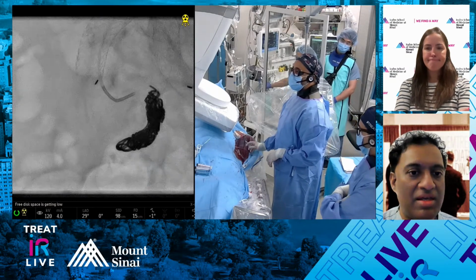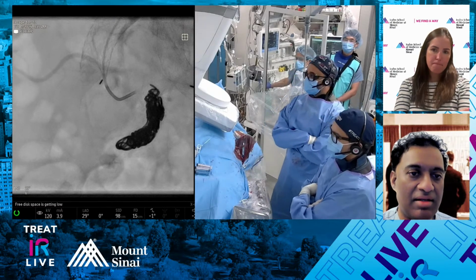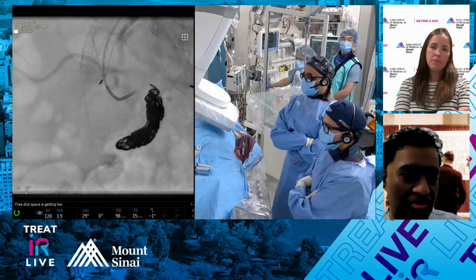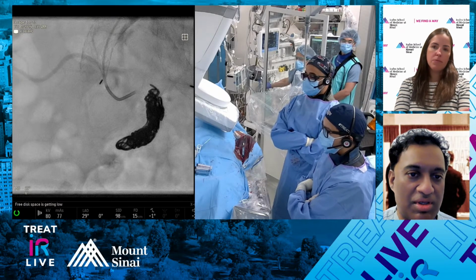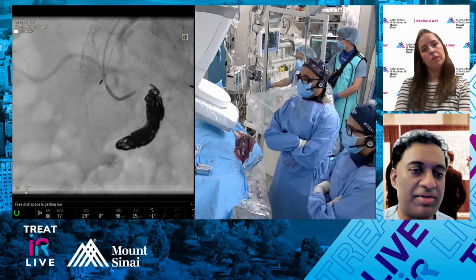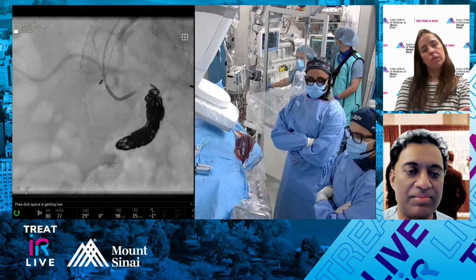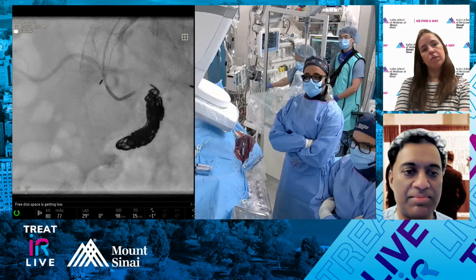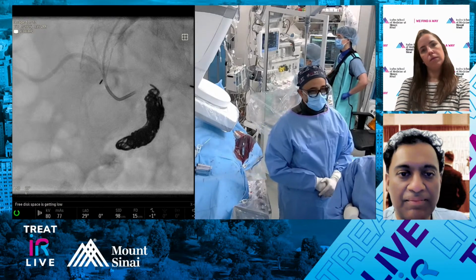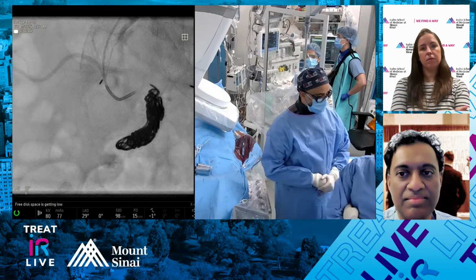And what's your stopping point? I think if you're not planning on putting the covered stent in, I would be more cautious of going too distal. One other thing you can do, if you really want to, is maintain this. You put your ipsilateral limb, your 12 French transfemoral. You deploy that, and you can finish coiling up, ad nauseum, right? So that's another technique I sometimes employ. Put a catheter, whatever you want. Yeah. And then stent, and then finish coiling. They have the lantern. And then can I get a fathom?